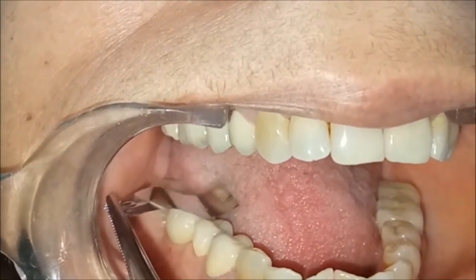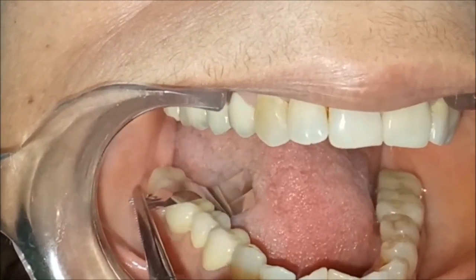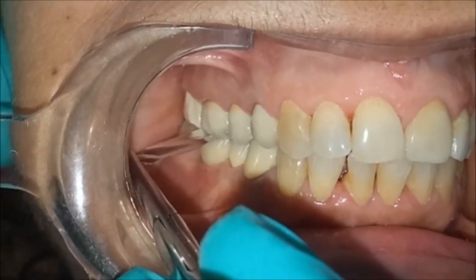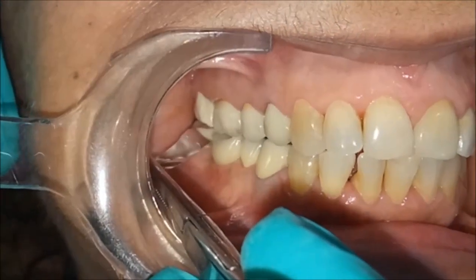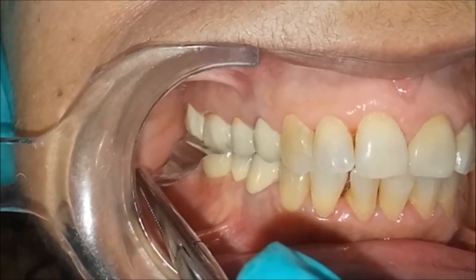I am going to first try this on my implant crown. I am going to keep it on the occlusal surface of the crown and gently close down. I am able to pull the shim stock through — that's what I want. In static occlusion with a light bite, I do not want any contact on my implant crown.